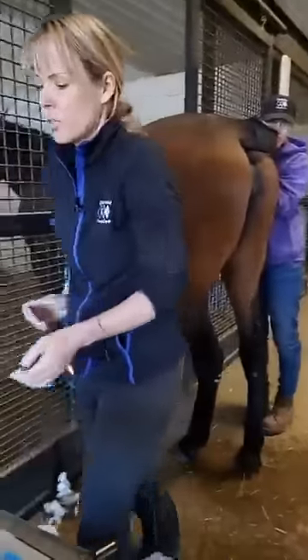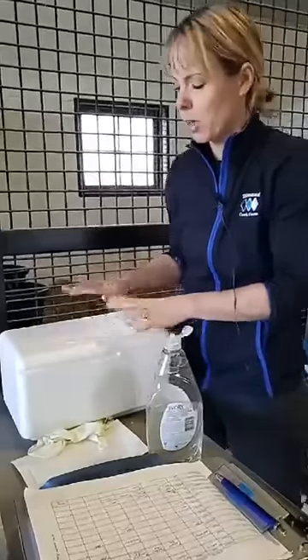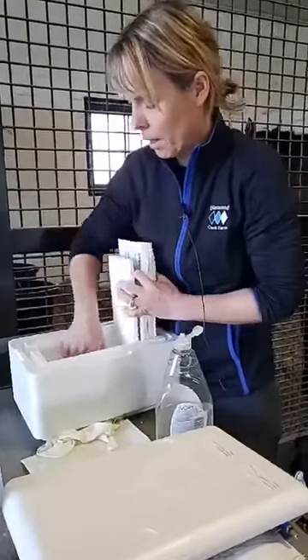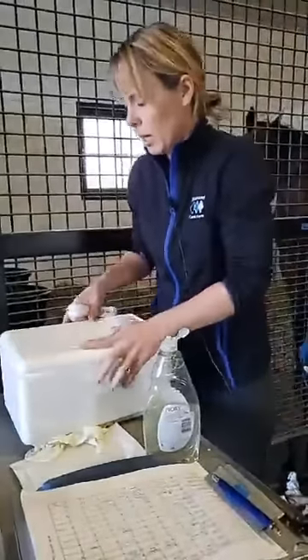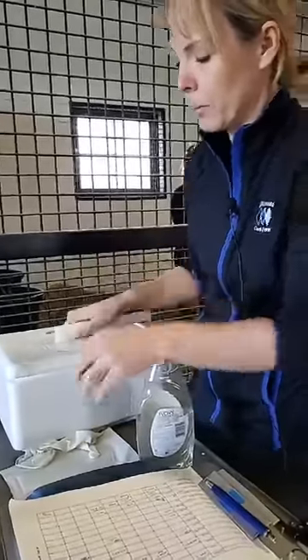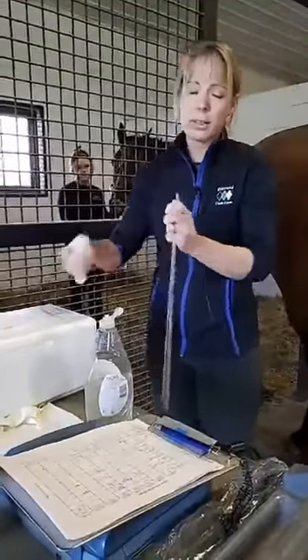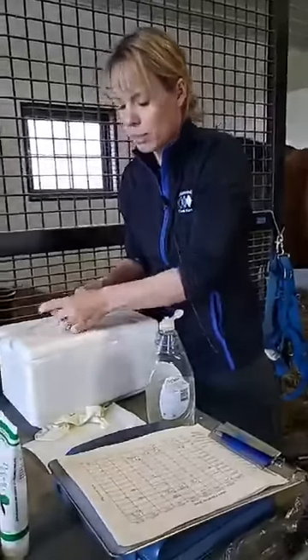Now we're going to open the box. Most of you, when you get semen boxes, have a styrofoam container inside a cardboard box. Since we're breeding her on the farm, we didn't put it in a cardboard box — we just left it in the styrofoam, which is perfectly fine. I pull out her syringe and again I want to make sure it says Father Patrick, Piranha Fury, today's date, and her tattoo number, because sometimes syringes get shipped in or — like today, we bred two mares — they get sent in the same box. So you want to make sure you're getting the correct stallion's semen for the correct mare.